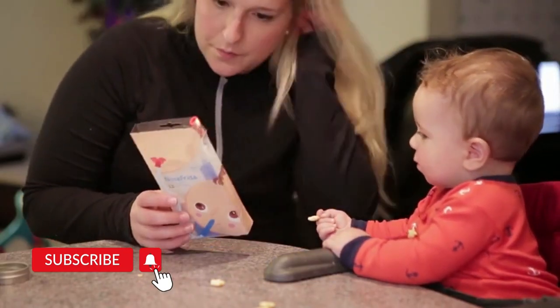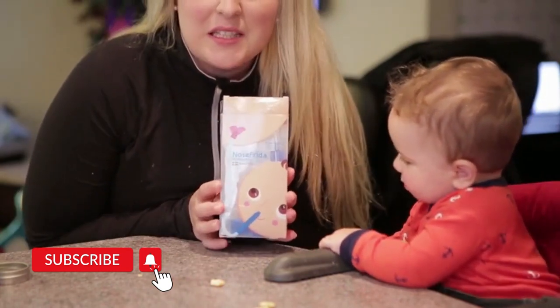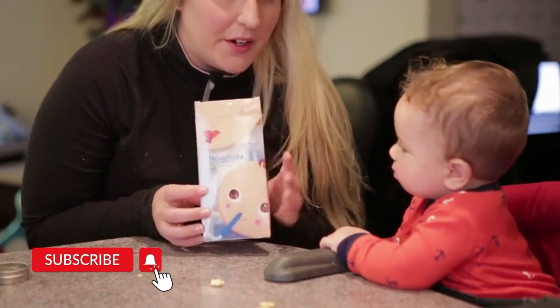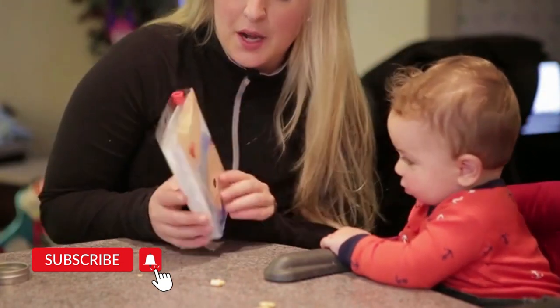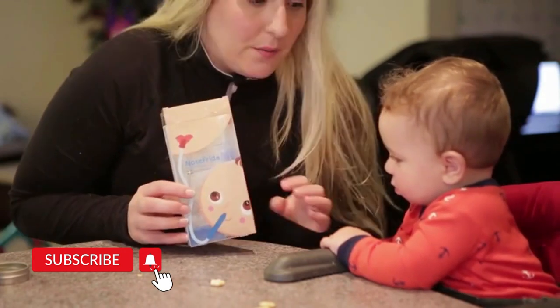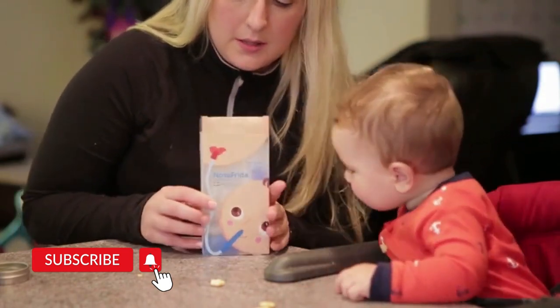This is the NoseFrida — it's the snot sucker. It's a little weird to conceptualize, but it does work. When your baby has a cold, it does the job. My husband won't do it because he gets grossed out by it.